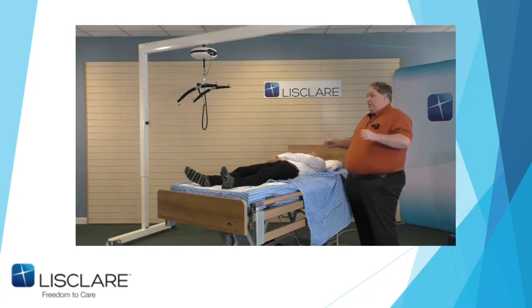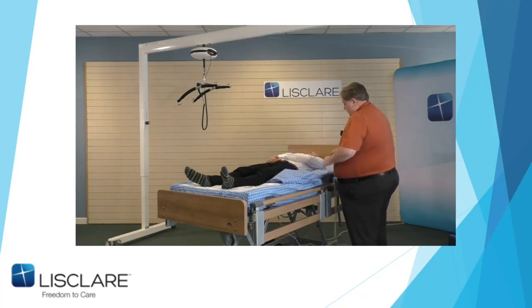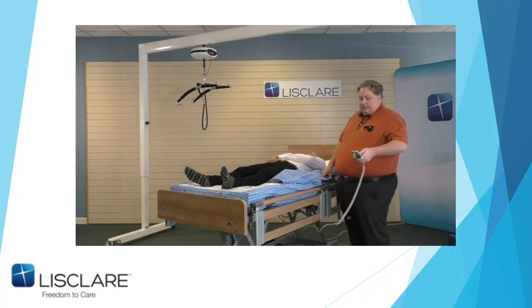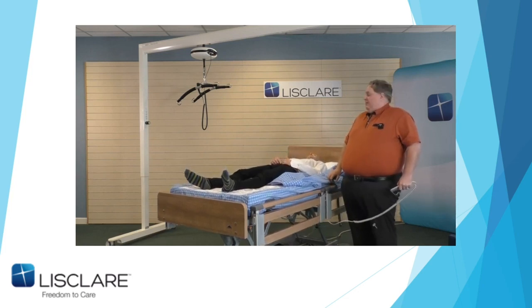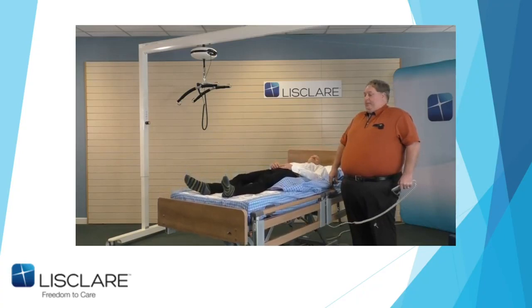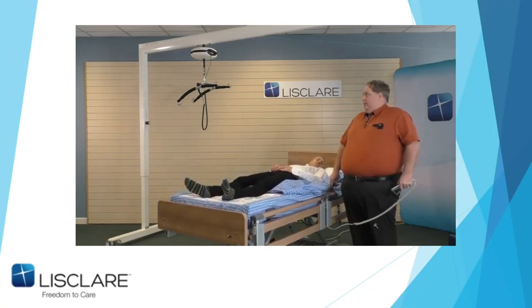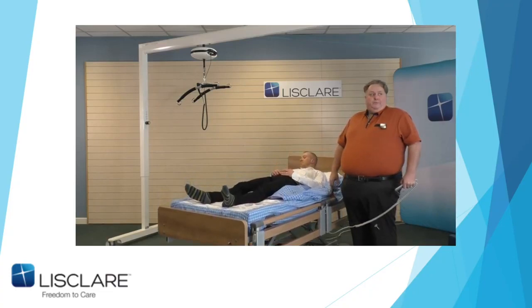Now, we went through how to do different things with a patient that's positive active, that's negative active up the bed. Now I'm going to do passive, and this is where poor John now gets involved in the lift. So I'll lower him down, and to show you how this can be worked, and John might not get stage fright just yet, this is his second webinar, he's going to move me up the bed. Obviously lowering it down, it's high enough for John.